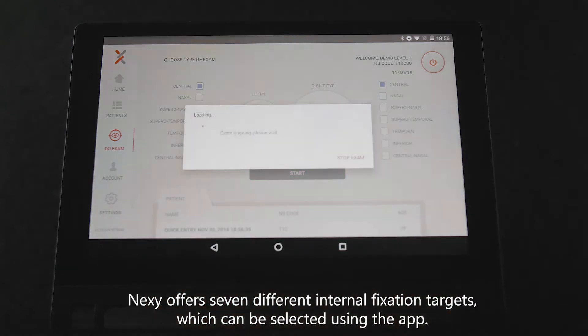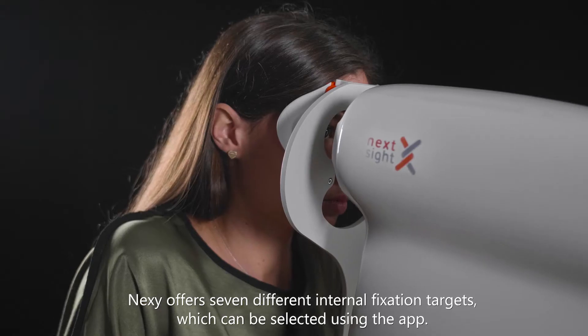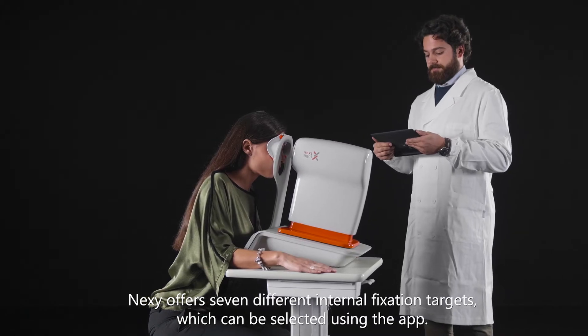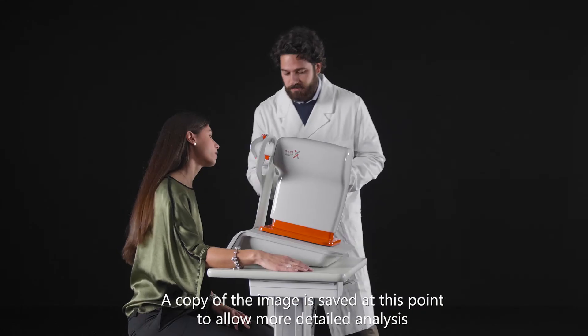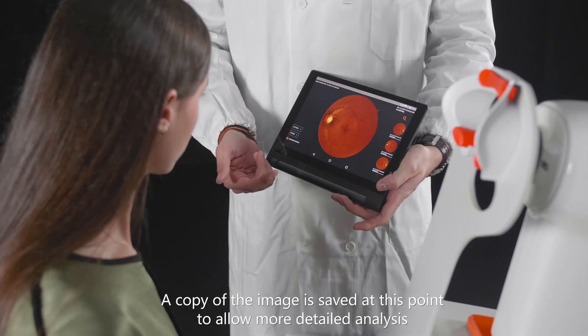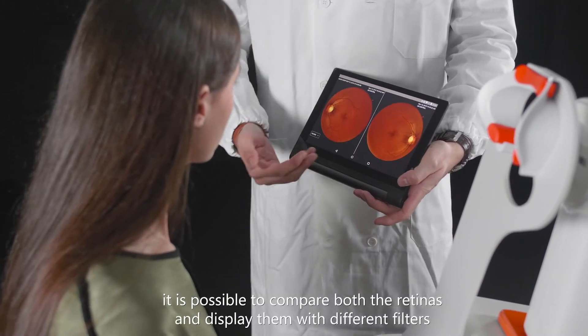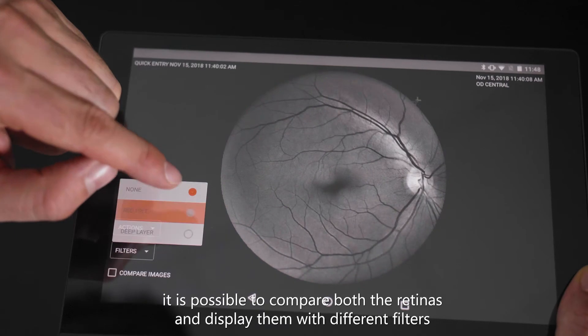Nexi offers seven different internal fixation targets, which can be selected using the app. The image appears on the tablet after about 15 seconds. A copy of the image is saved at this point to allow more detailed analysis. It is possible to compare both the retinas and display them with different filters.